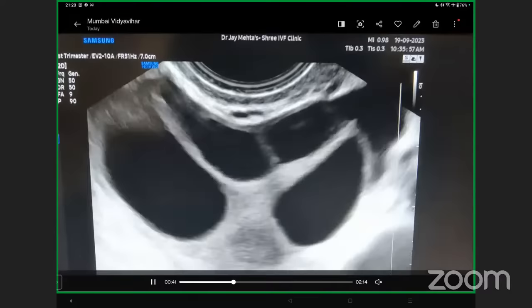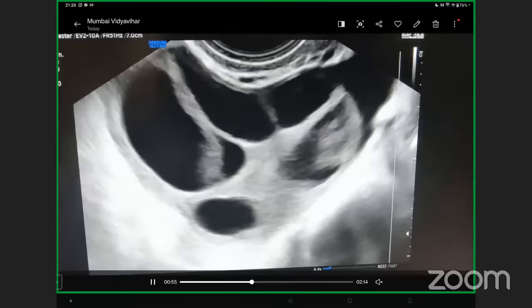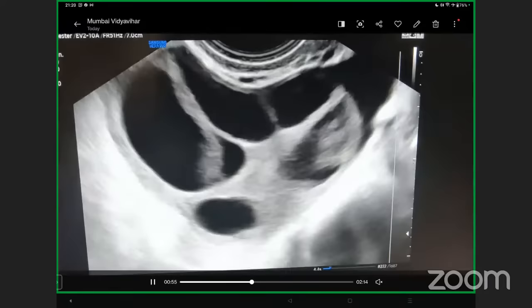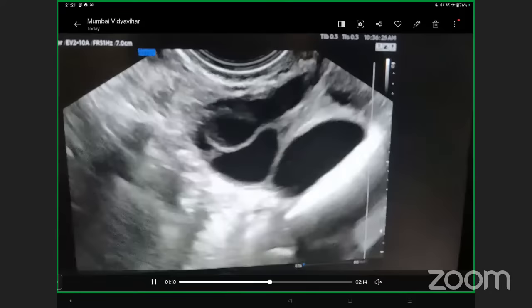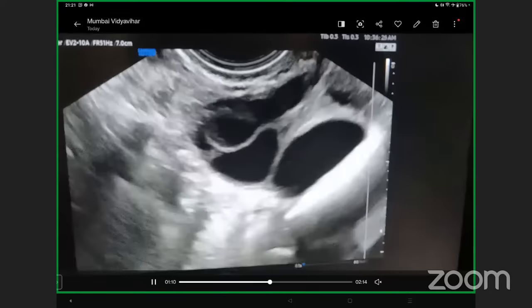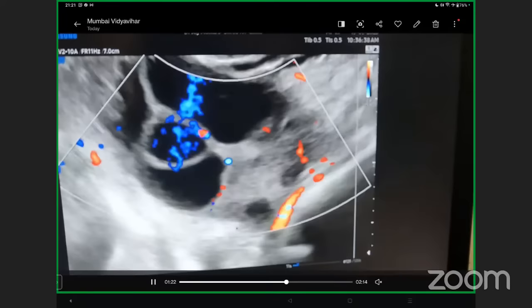A common mistake: your radiologist may report a follicle as 14 mm when it was actually 18 mm. Taking the largest longitudinal measurement gives 20 mm; someone using the other plane may report 14 mm. Because of these differences, if you have more than two or three follicles more than 18 mm, even if somebody else did the ultrasound, there is absolutely no need to worry.